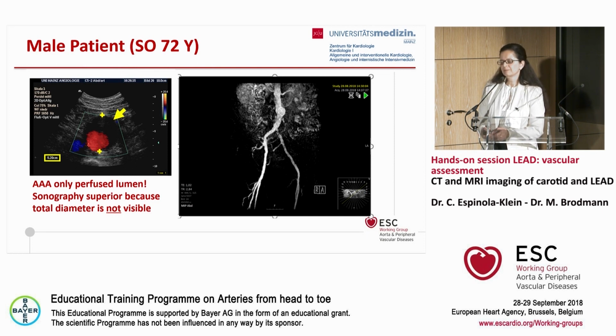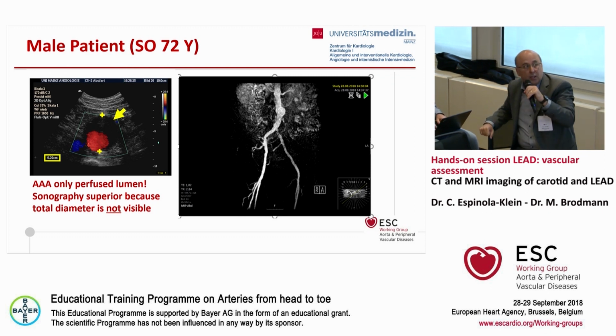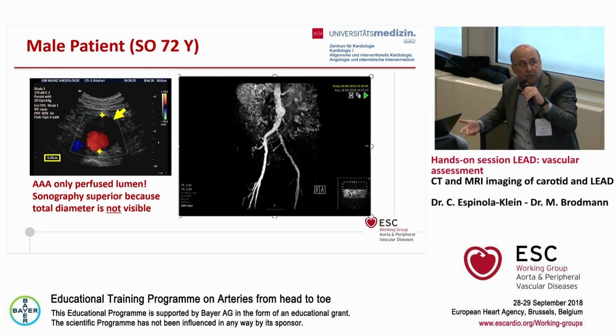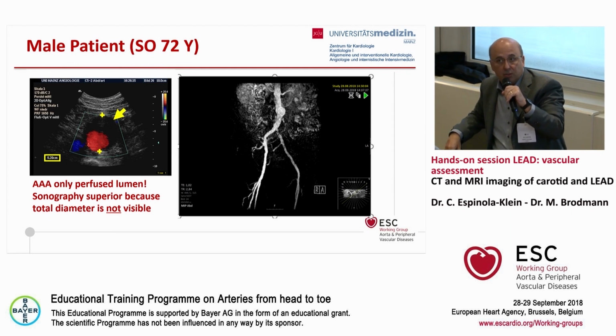Follow-up of a small aneurysm before reaching the size for any intervention, which is maybe too late here because we have 52 millimeters. But then you have the follow-up of patients who have endografts, or patients who have been operated. So the follow-up is not the same, and even the imaging method that you would use wouldn't be.